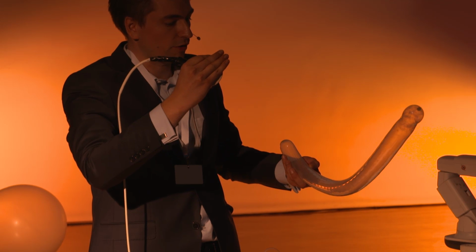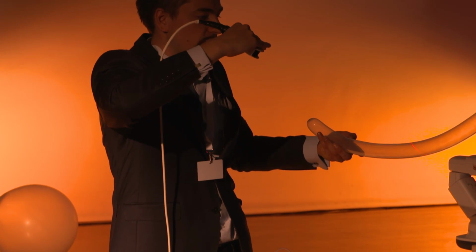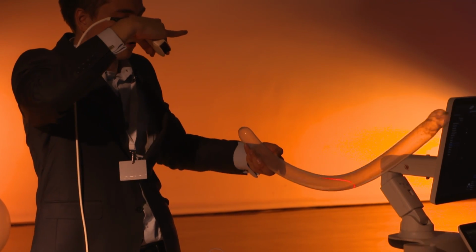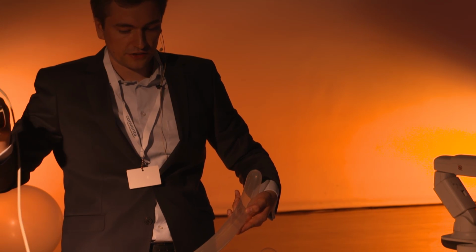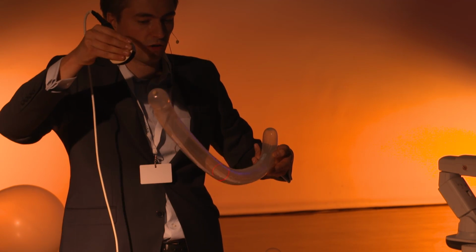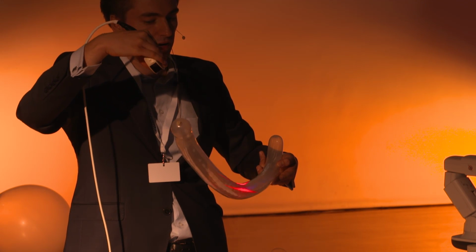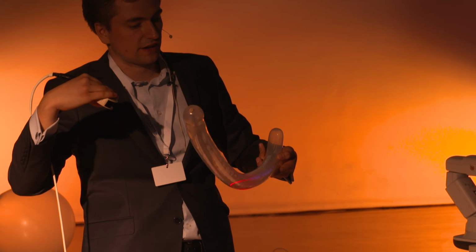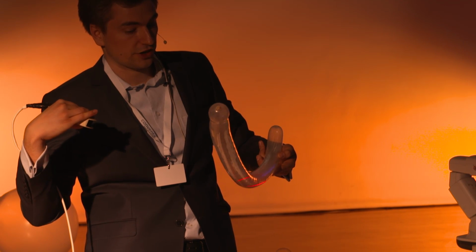Control your probe properly, and if you have it in the middle, just turn all the time in just one axis, and you can follow the structure. If you're trying to just move around, you will definitely lose the structure. So all the time, have it in the middle, just move your probe in one plane, and then you can scan it properly. And I can see the structure actually right now.